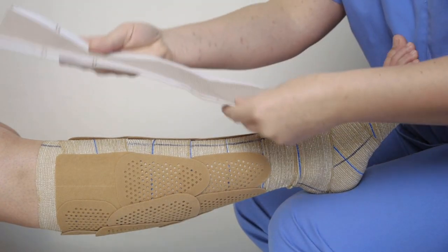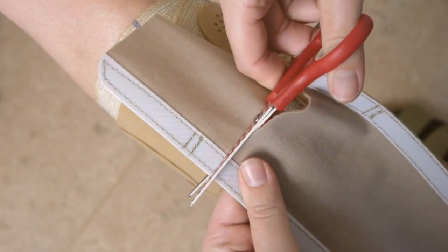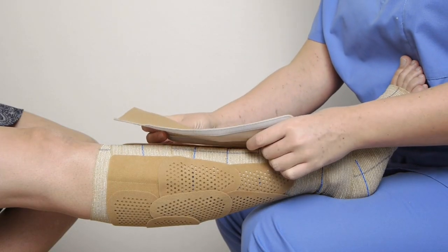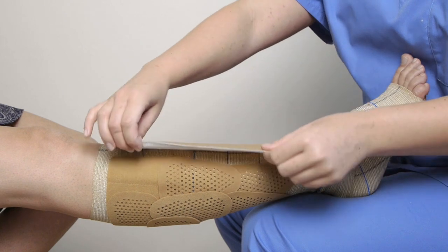Cut fix patch to fit the area covered by press patches. Attach fix patch to one side first, stretch it slightly to remove any creases, and then attach it to the other side.